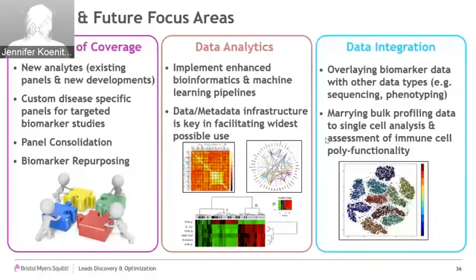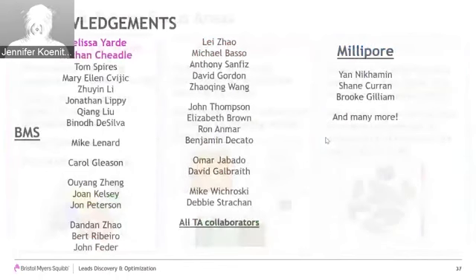And lastly, an effort that we have ongoing focuses on new technologies that allows investigating the cytokine profile of a single cell. As we know, immune cells in particular show very heterogeneous responses to treatment. And ultimately, we want to marry that single cell data to the bulk biomarker data that we routinely produce from the Luminex profiling.